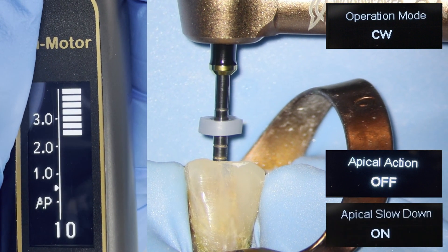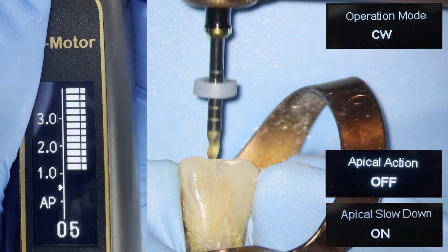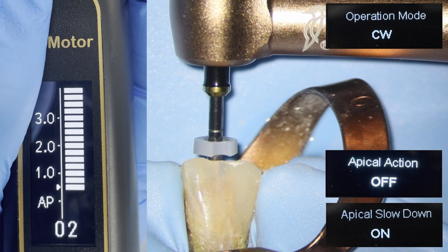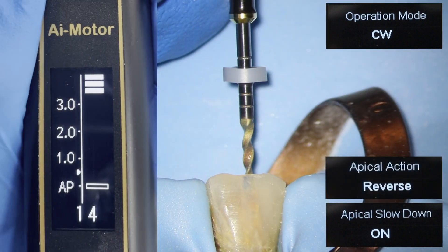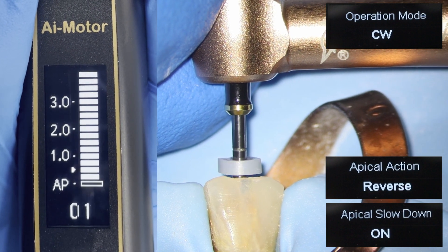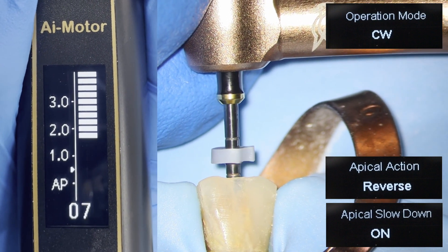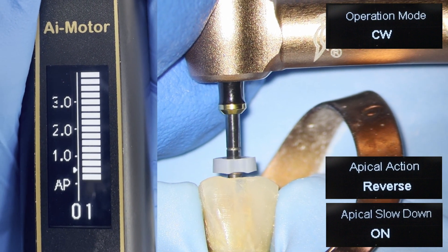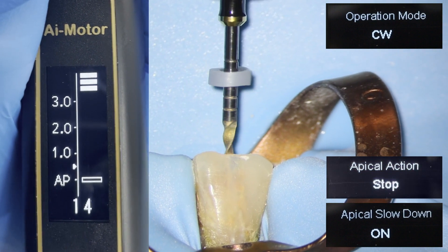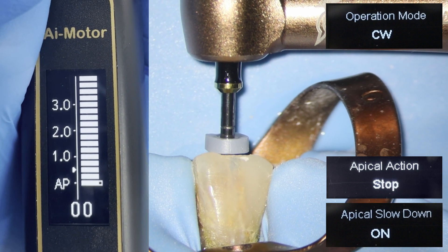With apical slowdown on and apical action off, the file will slow but not do anything once it reaches the apex. With apical slowdown on and apical action set to reverse, the file will slow down as it reaches the apex, and then reverse outwards. With apical slowdown on and apical action set to stop, the file will slow down as it reaches the apex and then stop.